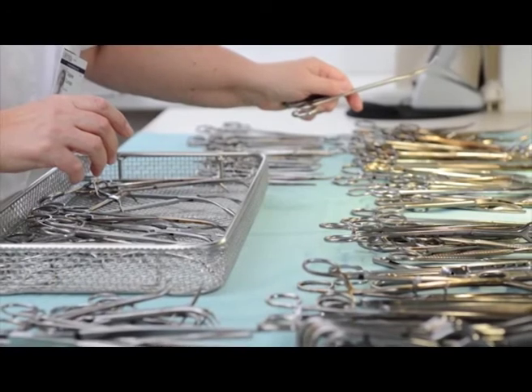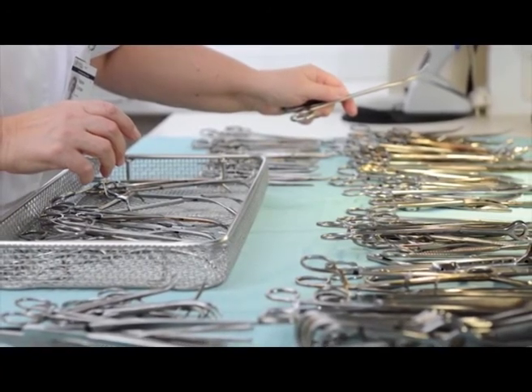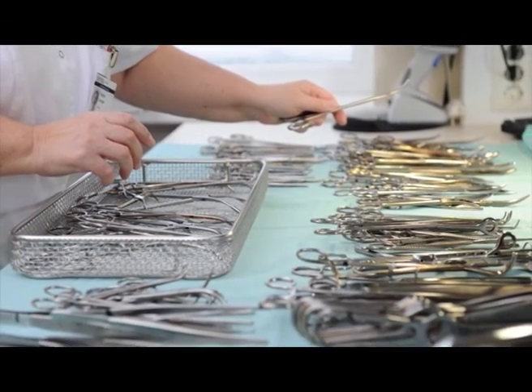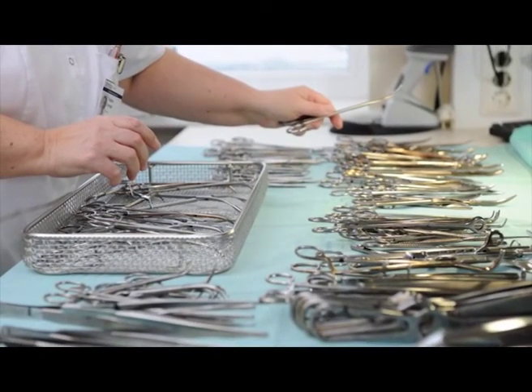To satisfy the above stated conditions, there are 4 systems in use. The one or mix that suits should be selected for a particular CSSD. First, the 1-for-1 exchange system. All the used articles are collected in locked canvas bags, and a similar number of packs and trays in sterile state are returned to the respective areas. 2 such rounds of collection and distribution are done in a day.